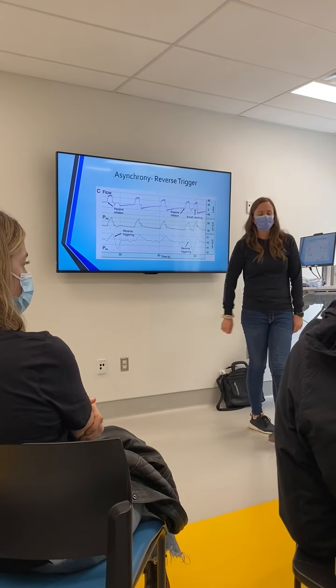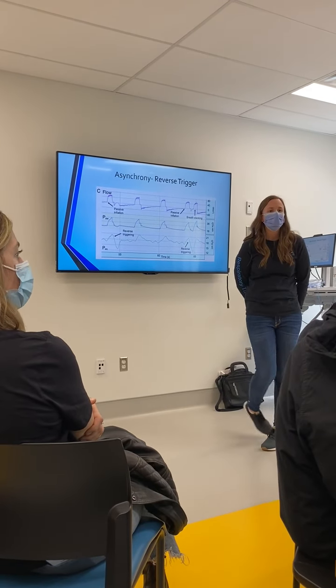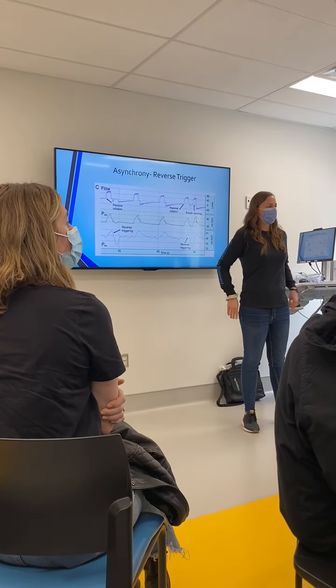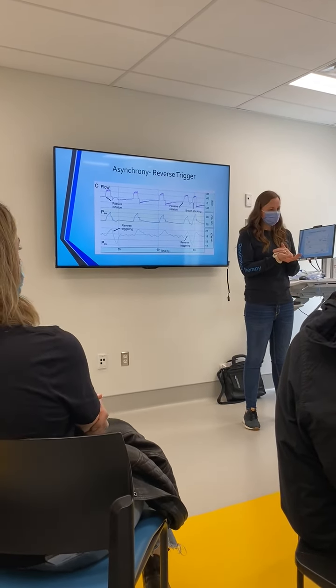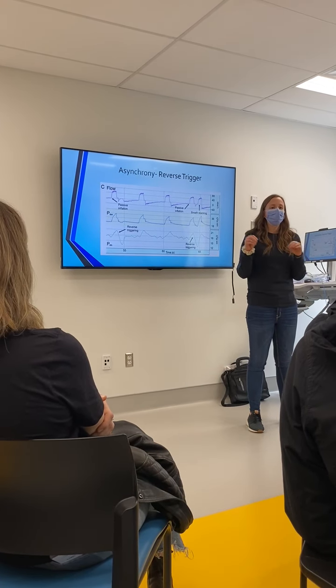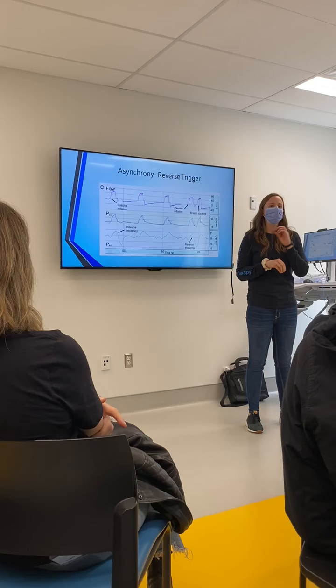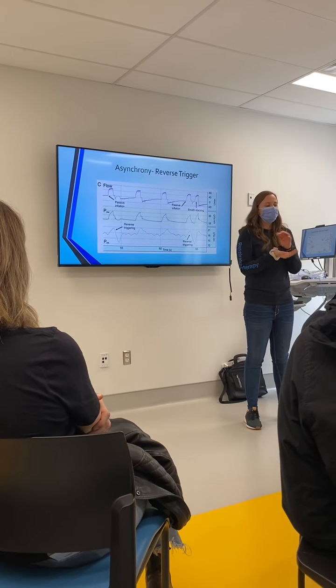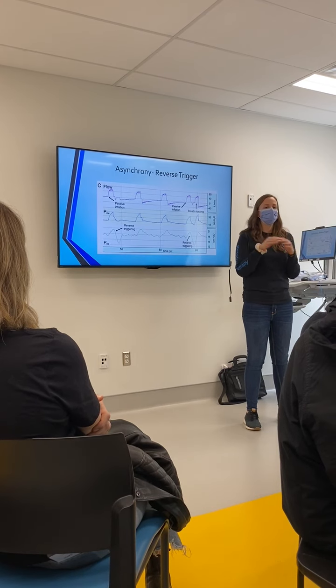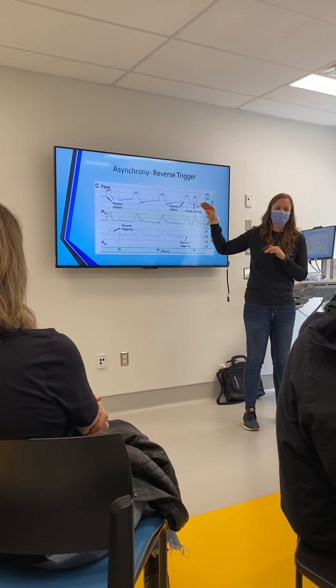Yeah? So if they're prone, is the breathing totally inaccurate? Good question. I actually asked one of our docs about this. When you prone someone, it's not completely inaccurate, but you just have to know how to interpret the values. You can still take your measurements, but if you think about it, your heart is no longer pressing on your esophagus, so the pressures should be different.